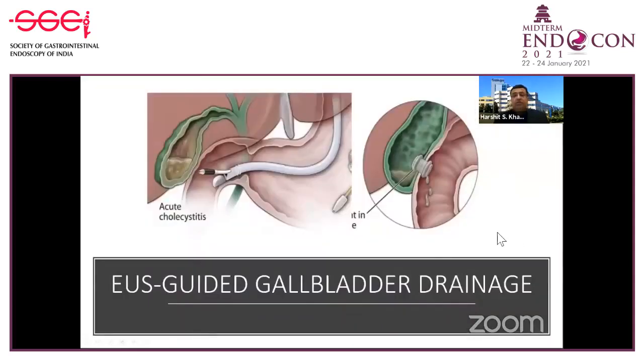The alternative to endoscopic drainage would be an endoscopic ultrasound guided drainage of the gallbladder, which is a relatively new technology, and I'll share some of my personal experiences as well as scientific data around this procedure.